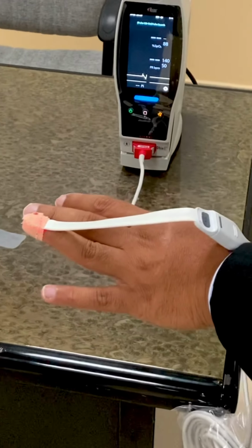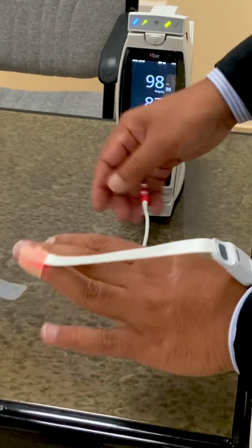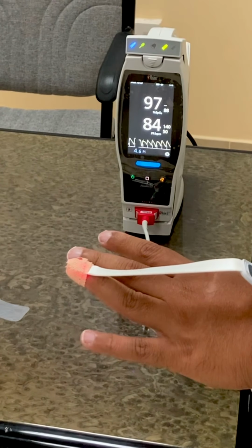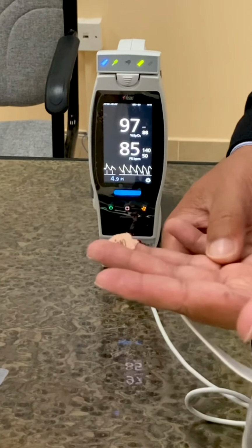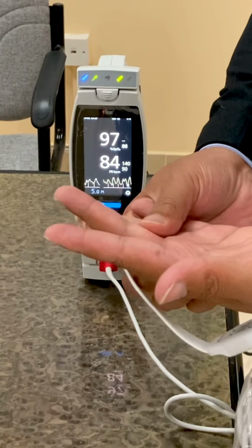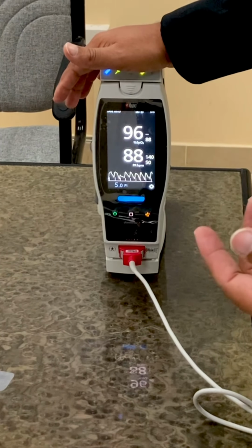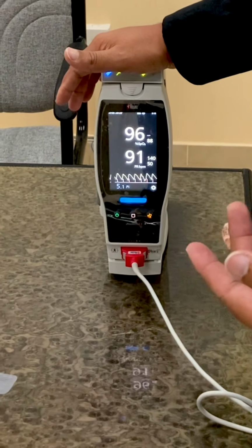And wait for a second. Start reading. I got a good PI, that means the area, the digit I selected is very good for the result. Less than 1 is poor. When it is less than 1, you just need to check the hand whether it is very cold or not. If it is cold, then warm it up, or check another digit which already has a good PI. But the good thing is, the device will read the values even if it is a very low PI, a very low blood flow.